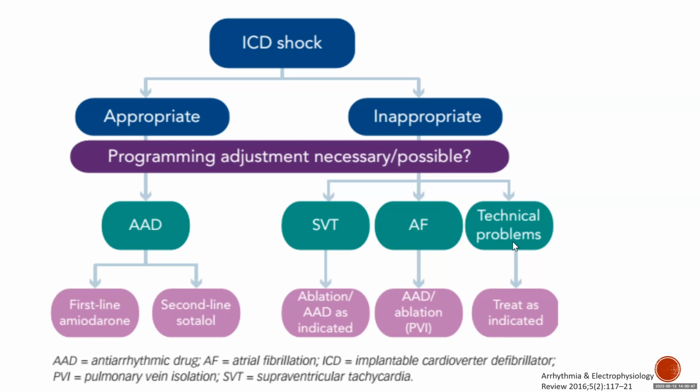Or it could be a technical problem, like lead fracture. We said lead fracture can cause artifact in the lead, which can be interpreted as intrinsic activity. And if it's frequent, it will be interpreted as VF or VT, and it will deliver a shock.